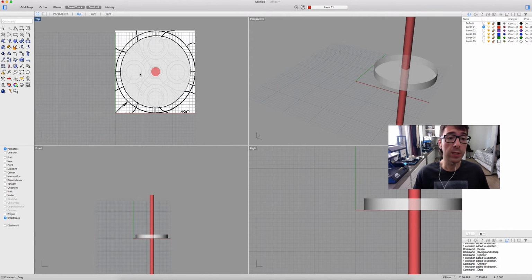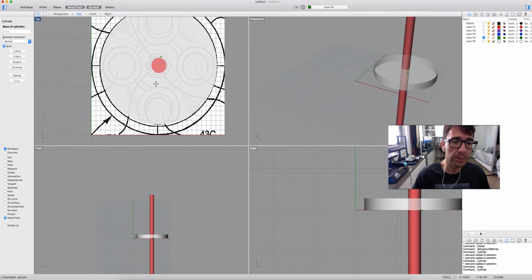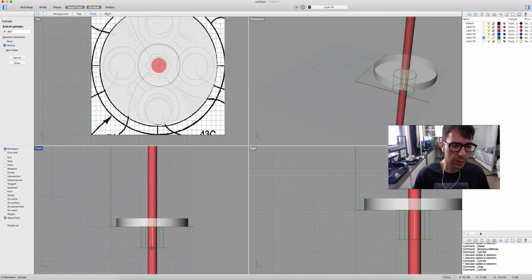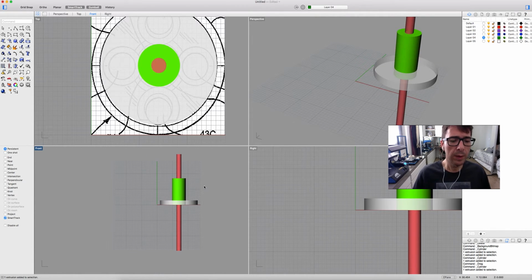Now we are going to design the central peg. I'm going to change colors again. Solid, cylinder, here the central pin guide. We can choose the diameter as we want, and the offset. The offset is 18, if I'm sure. So here we have 18. Now we have the base plate, the central pin guide, and the peg.